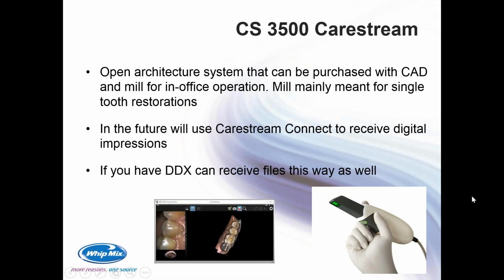Then the Carestream 3500, this is yet another open architecture system, and it can be purchased with, they now are offering a CAD system and a mill for in-office operation. Again, this mill, the mill that they offer, is really mainly meant for single tooth restorations. And the system is powder free.